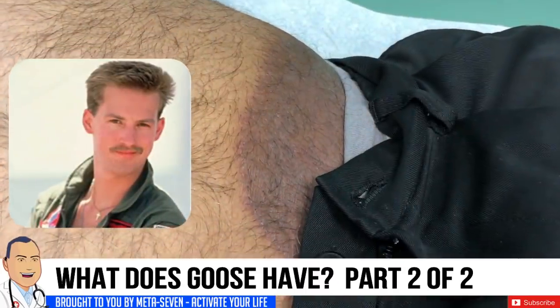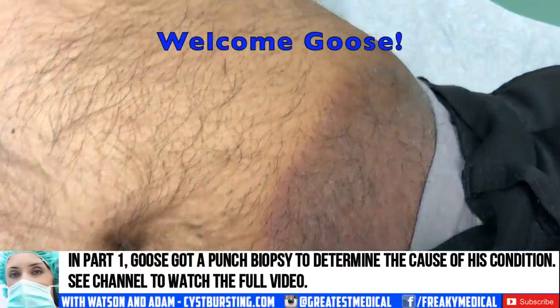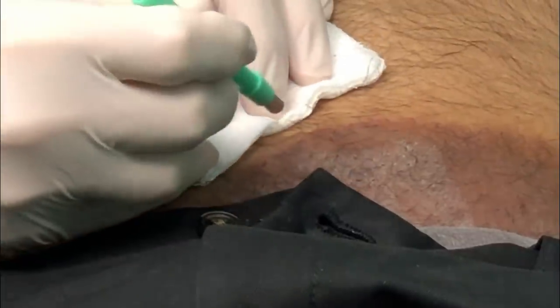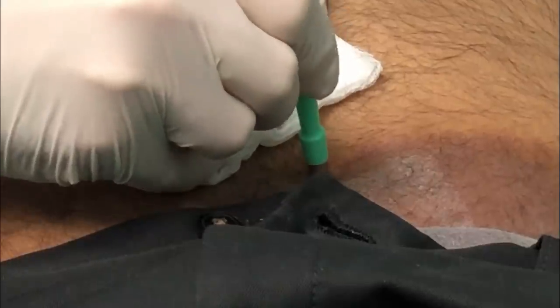So I'm going to give you a nickname if you don't mind — I'm going to call you Goose. You've got this large patch on the side of your lower abdomen here. This is a very sharp six millimeter punch biopsy tool. I'm going to get right at the leading edge of this.